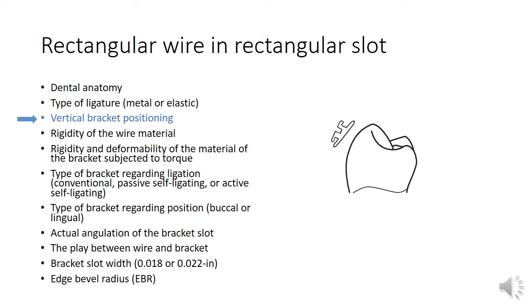Please note that in order to have a truly straight wire system of brackets, the torque angulation of all brackets should be in line with other teeth in the dental arch, and the necessary condition for this situation is bonding of all brackets on the center of clinical crown point or CCC point or FA point on all teeth of the dental arch.